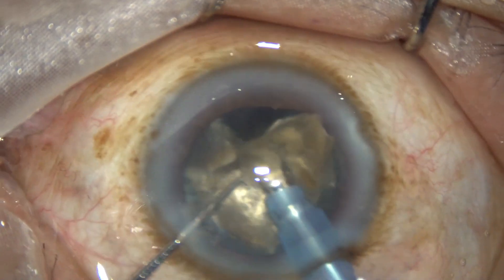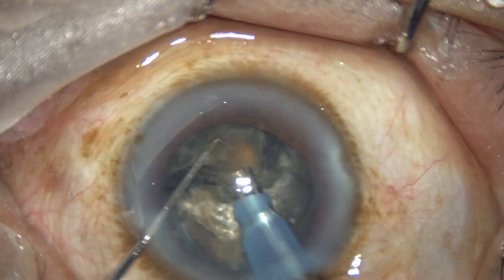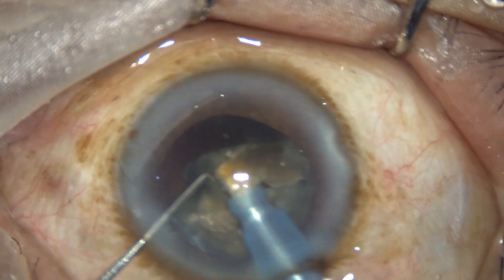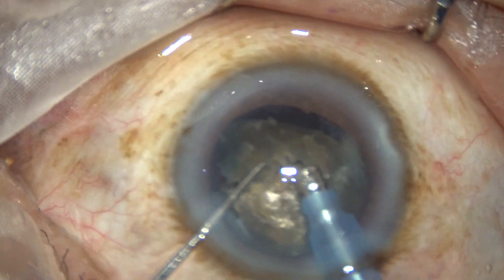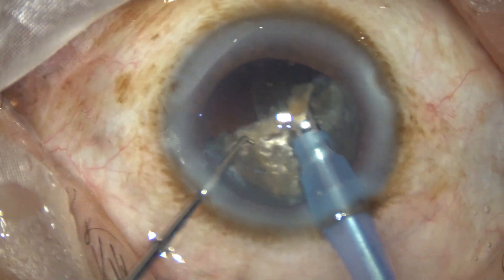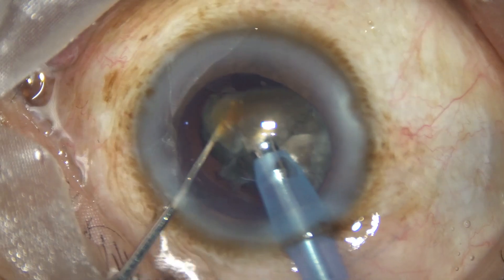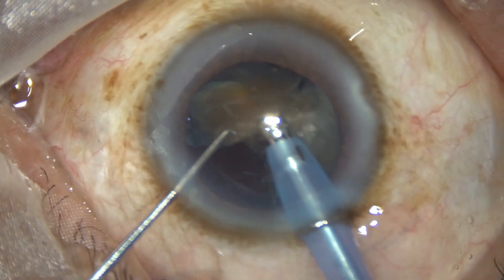One nuclear piece is now emulsified. The ultrasonic energy used in this hard cataract is 85 percent in continuous mode. Flow rate is 45 ml per minute. Vacuum is 450 mmHg. The machine is an Oertli cataract system. We have no financial interest, but we can do hard cataracts with this machine. This is not a high-end machine — it is a mid-range machine, and we can manage all types of cataracts with it.